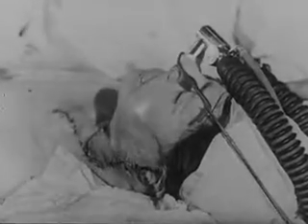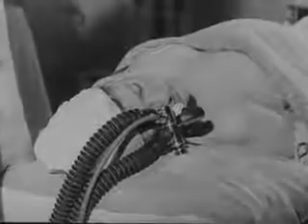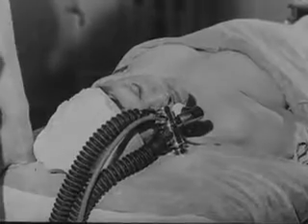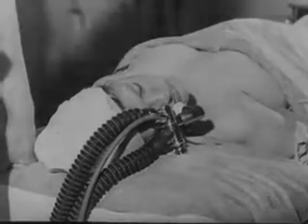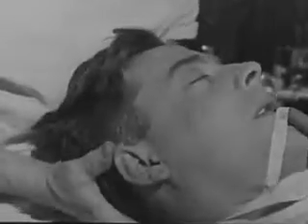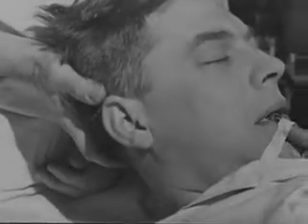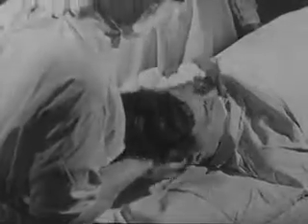The main advantage of endotracheal anesthesia is absolute control of the airway. Once the tube is in the trachea, the breathing will remain free and there will be no possible danger of respiratory obstruction. This holds true irrespective of the position of the patient's head. Certain positions on the table make airway control difficult. By using an endotracheal tube, this difficulty is overcome.